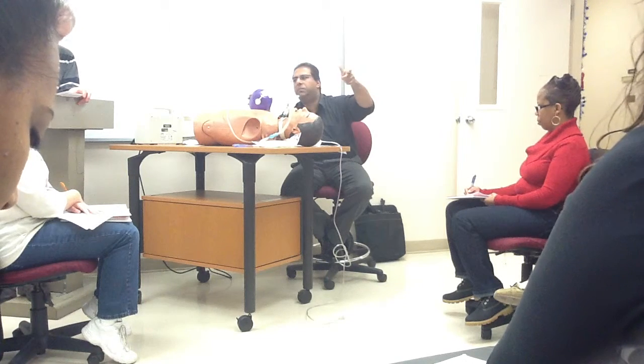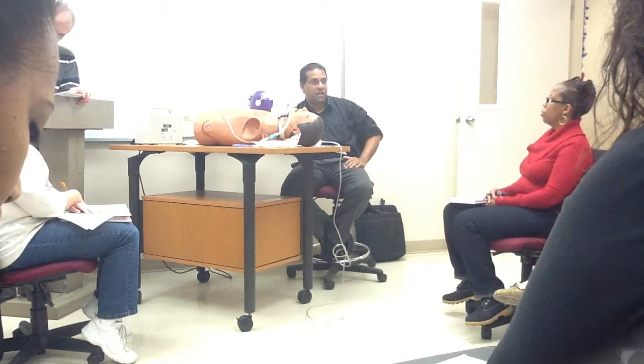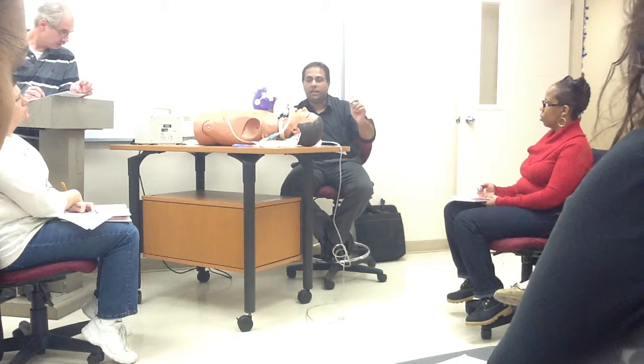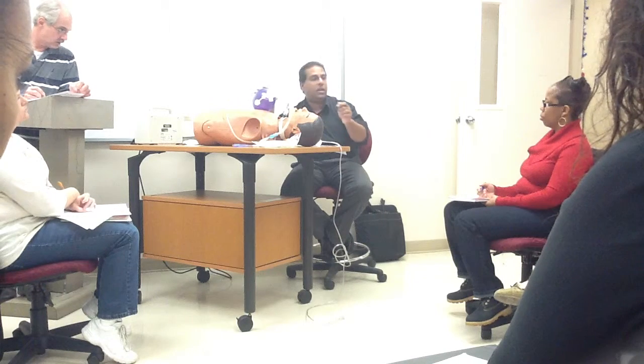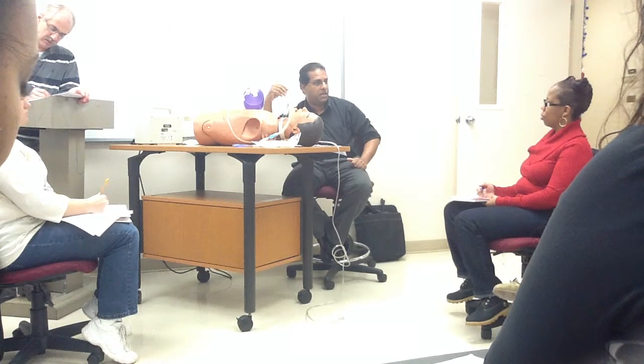And if the patient is not on a ventilator but on a trach collar, how do you hyperoxygenate? Well, a couple things you can do. You can hyperoxygenate by taking the patient's FiO2 from whatever, like if they're on 40, take it up to 100%. That doesn't mean that you're going to hyperventilate them. You're going to hyperoxygenate them, but you're not going to ventilate them. So if you see a patient that's shallow breathing, and you really want to hyperoxygenate and hyperventilate them, you really have to take them off and bag the patient. But if they're already breathing nice and smooth and normal, then you can just turn up the FiO2 on the bottom to hyperoxygenate them. Y'all getting what I'm saying?